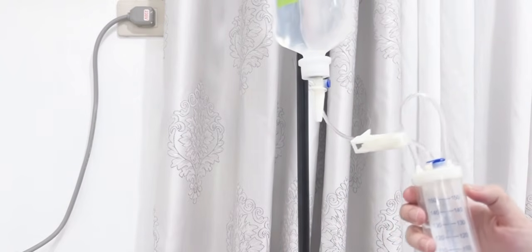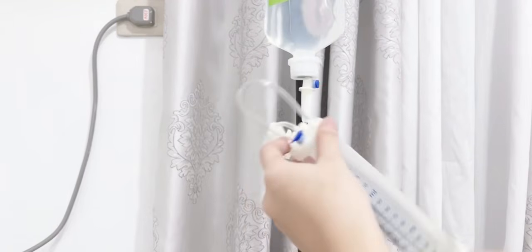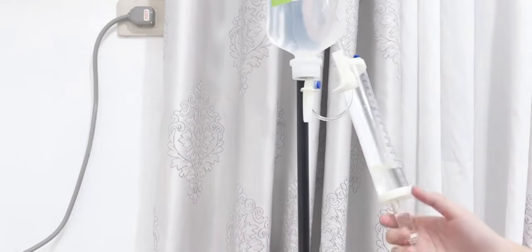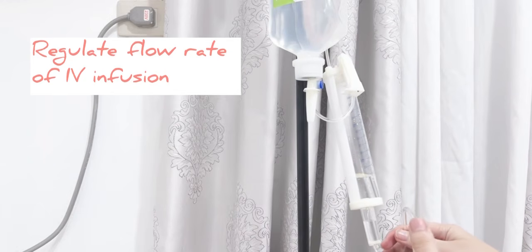After incorporating the IV drug, kink under drip chamber, then shake it side to side so that the medication in the Soluset will be distributed equally. Then put it on the IV stand. Then regulate the flow rate of IV infusion as it ensures medication is given over the appropriate amount of time.